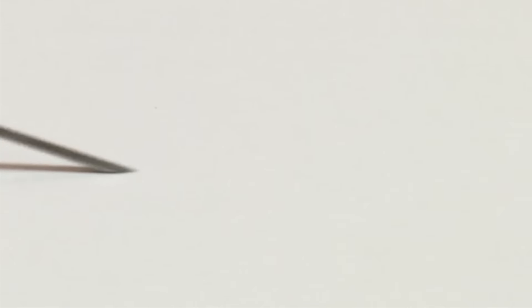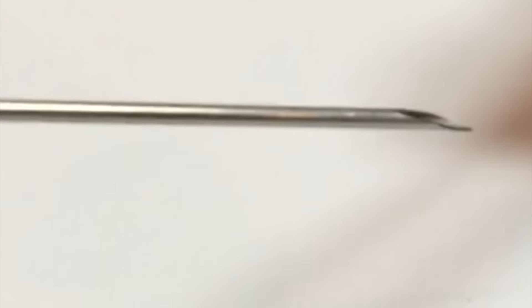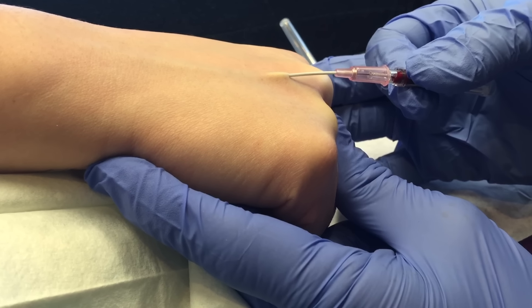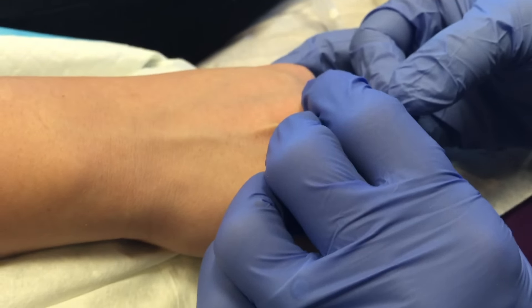Now this is a demonstration that the bevel side of the needle is quite dull. My assistant is pressing on the surface with the needle on a piece of paper, and you can see it does not catch one bit. Now turn the other way and push a little bit — she gets stuck immediately. The point is that side of the bevel is very dull, and if it is sitting on the vein you can actually put a lot of pressure on it and you will not do any damage. When you're on the other side it just gets stuck immediately. Remember: the trick to this technique is right after the flash you must lift up the needle tip and then insert about three millimeters in. Once the whole unit is in, you can then slide in the plastic catheter safely.